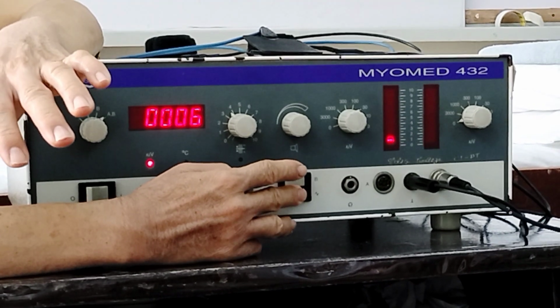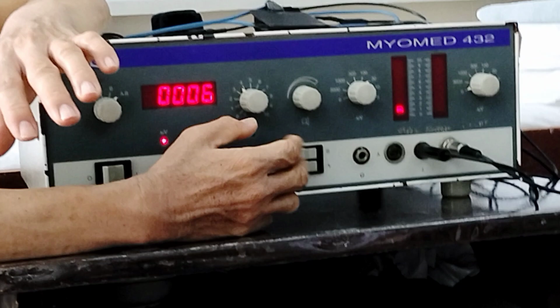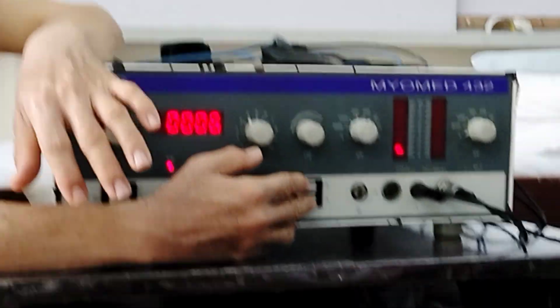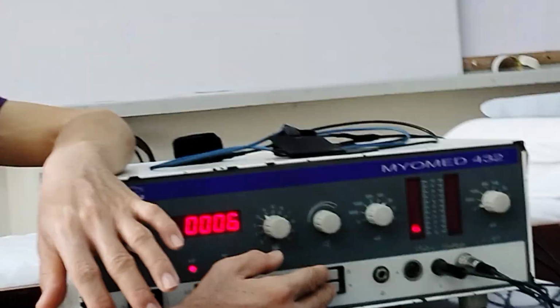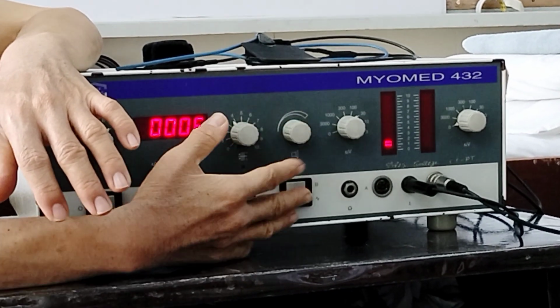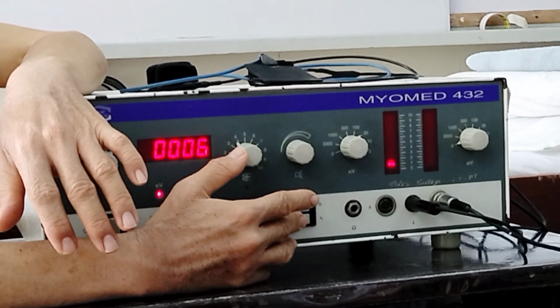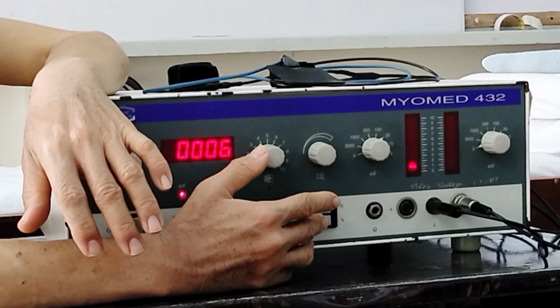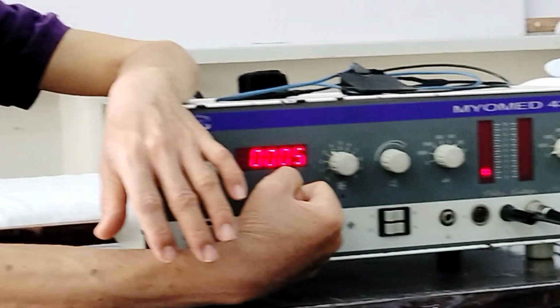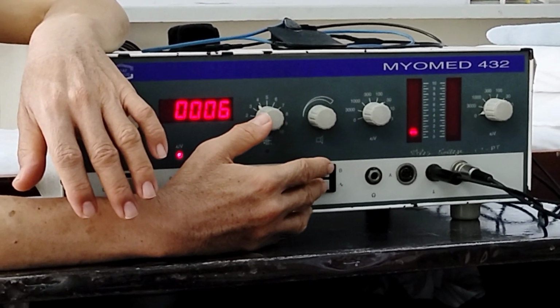And since the patient likes the sound, he will be more motivated to contract. If you use a sound the patient doesn't like, when you ask him to contract he won't be motivated, and if the sound is loud, he just won't contract. So if you want to increase muscle action and contraction, you have to choose a sound the patient likes to hear.